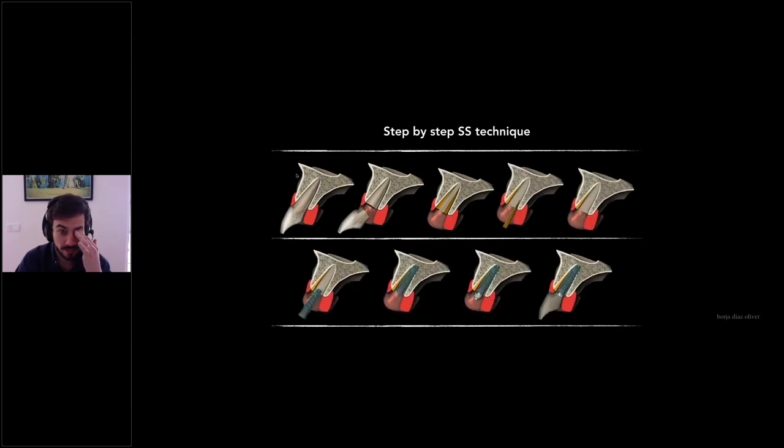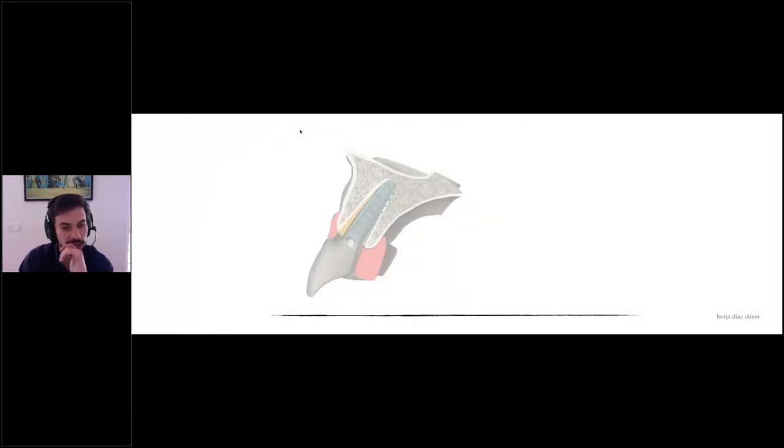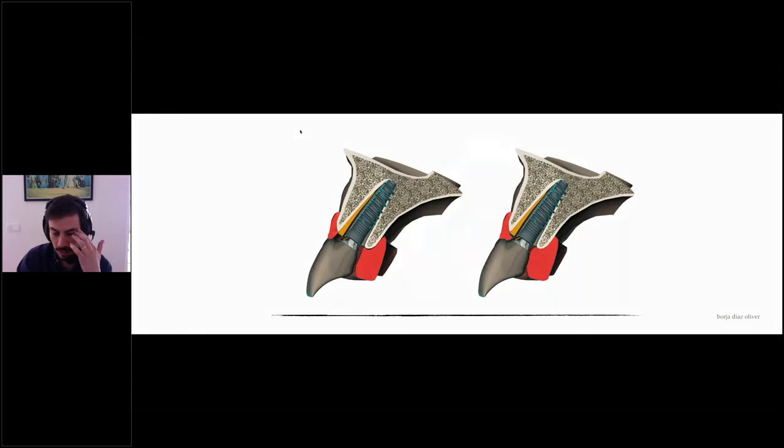So for the step by step of this technique, you can now see graphic animations. These images were given to me by my friend Borja Diaz, and they explain the technique really well, with a really cool graphic explanation. In this technique, we leave the buccal part of the root to maintain the periodontal ligament and the irrigation to the bundle bone, and the implant goes behind the root. Okay, here you can see some 3D animations of the technique.